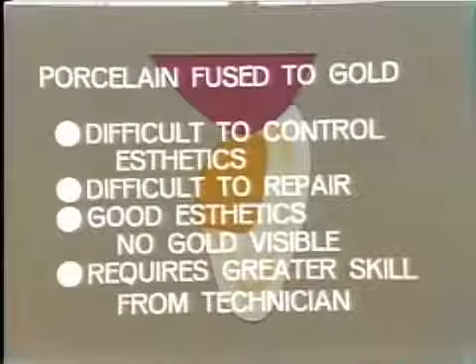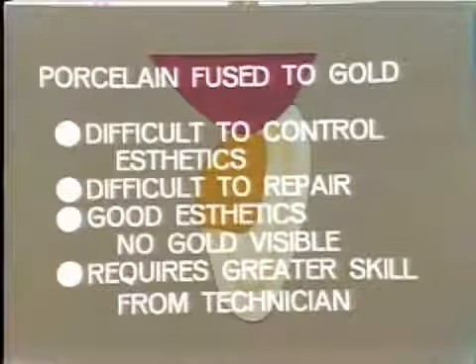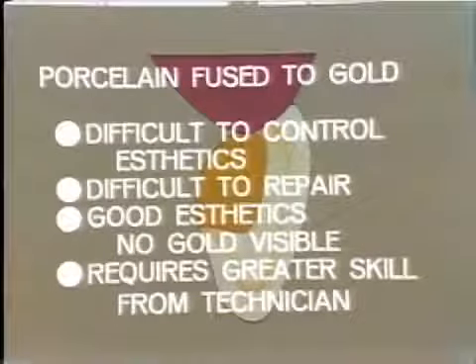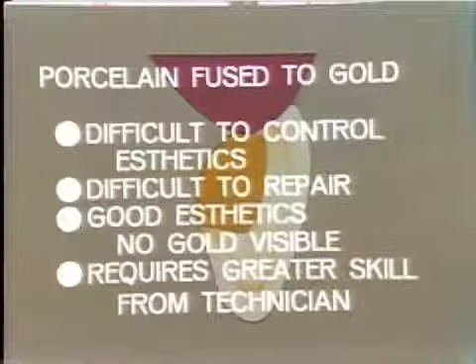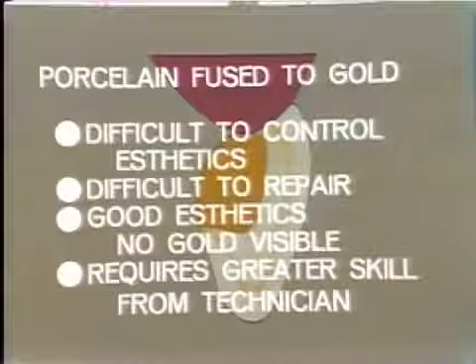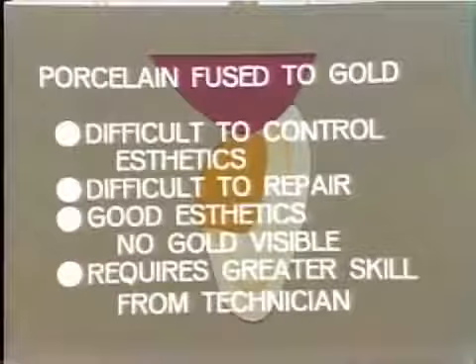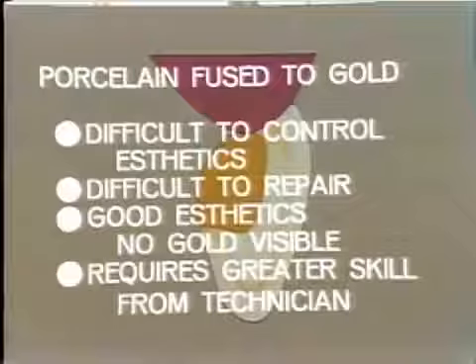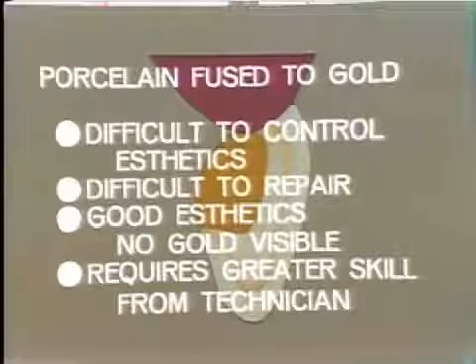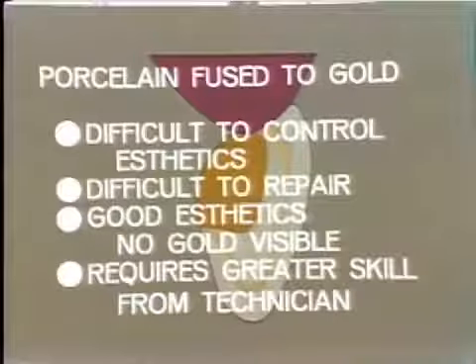To summarize the main points of the porcelain fused to gold Pontic, then, it is difficult to control aesthetics with this type of Pontic facing because you have no preformed porcelain with which to try out in the clinical case, and you do not see the finished situation until the bridge is complete, when it's often a little difficult to make any major changes. It is important, therefore, that you give adequate information to the technician on mold and shade, and whenever the situation is critical, to send them some type of preformed facing as a guide as to just exactly what is required. They are difficult to repair, but fortunately, if they're correctly designed, they very rarely break.